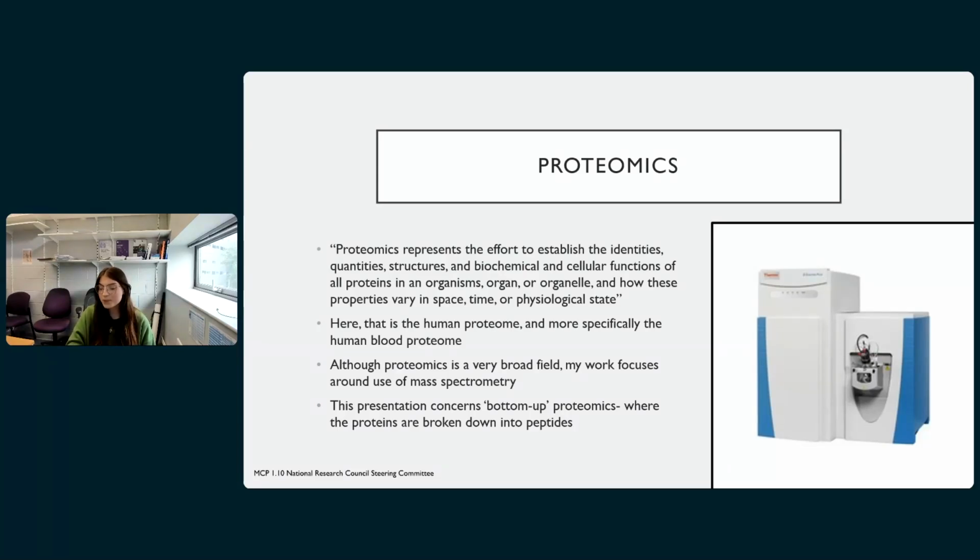So I'll be looking more at the laboratory workflow and how we actually process these dried blood spot samples once we get them out of the patient's hands and into ours. So for me, that is from a proteomic standpoint, being based at the Centre for Proteome Research. I thought I'd start with just a brief definition of what proteomics actually is, because I know that might not be something that necessarily everyone knows.